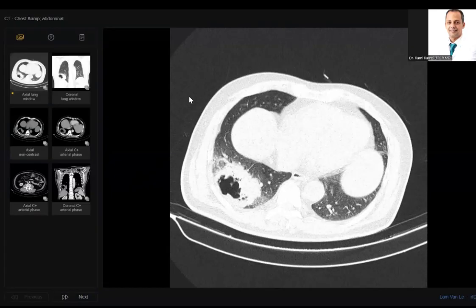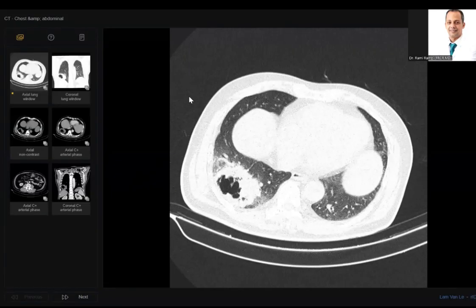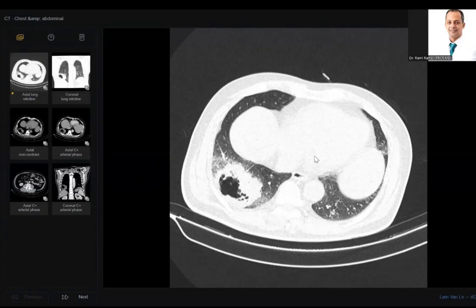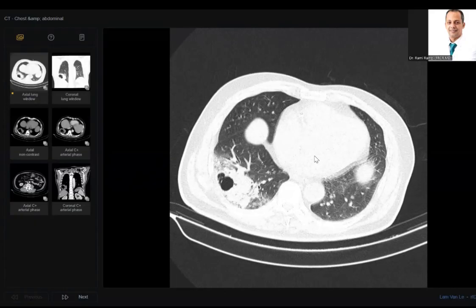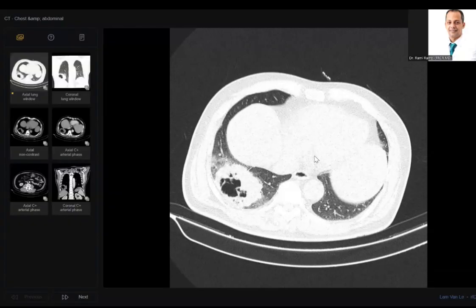Excellent. If I ask you, according to the CT, what is your next step? Sir, next for the lung lesion, we advise a PET-CT.